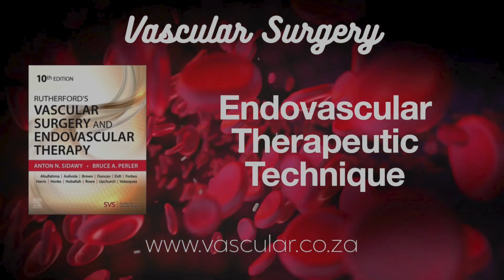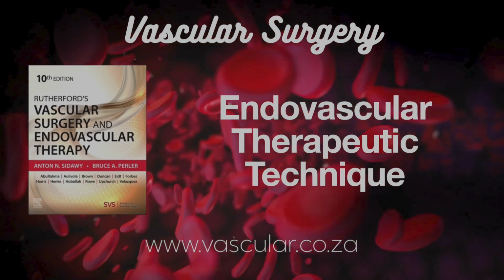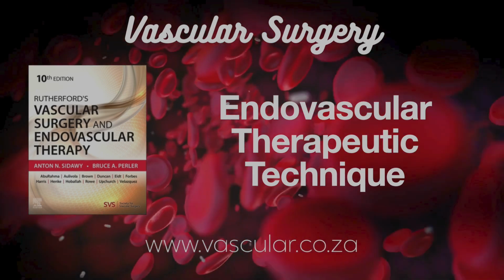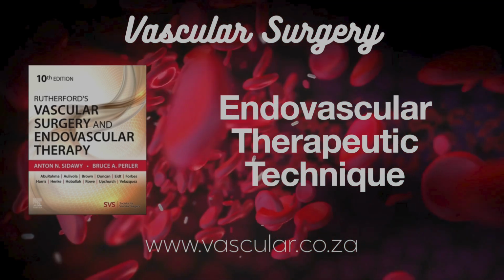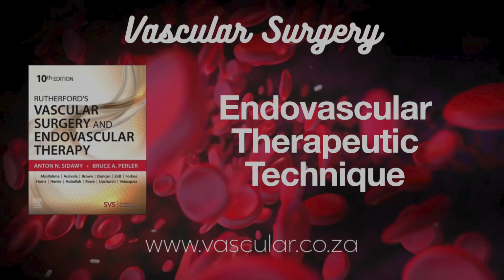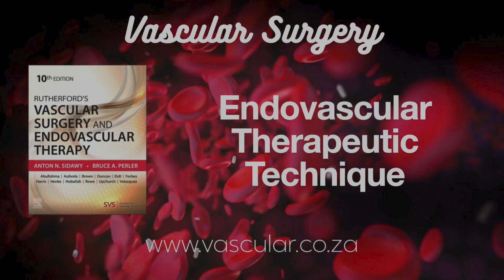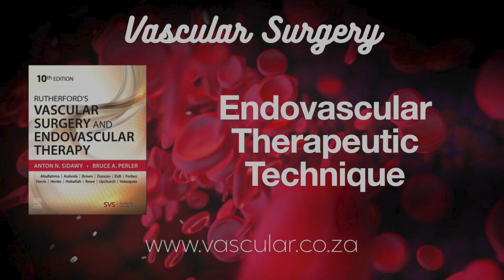For peripheral use, especially SFA and below the knee, they're typically over-the-wire dual-lumen catheters. Semi-compliant balloon, usually an atraumatic tip so it doesn't damage the vessel. And a key recommendation is a long inflation time. How long? Minimum 60 seconds at the target pressure. That's crucial to give the drug enough time to transfer from the balloon coating into the vessel wall tissue. And the drug is usually paclitaxel. Paclitaxel is the most common one used in peripheral DCBs, yes.